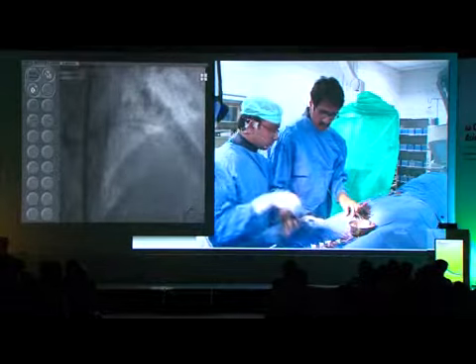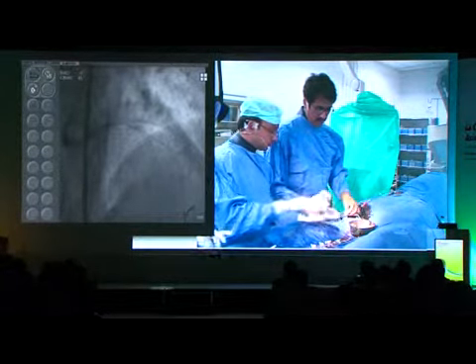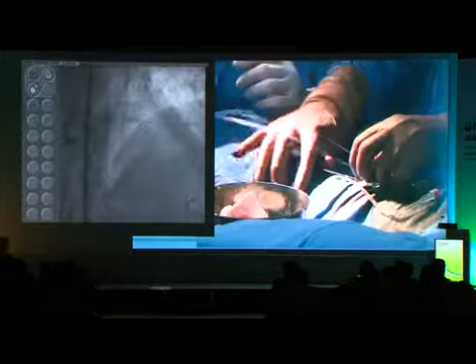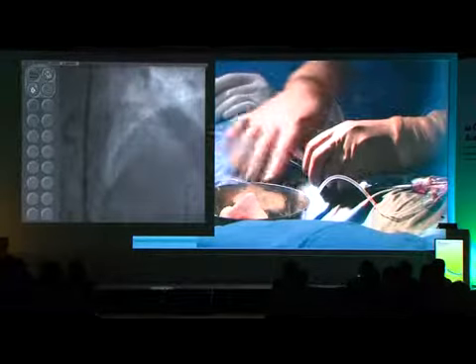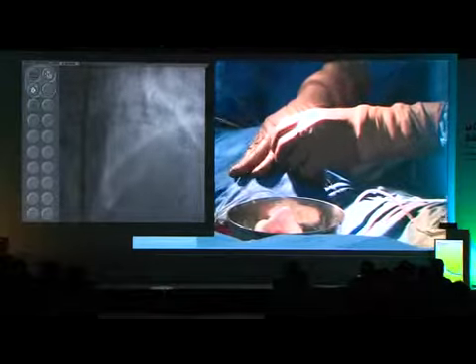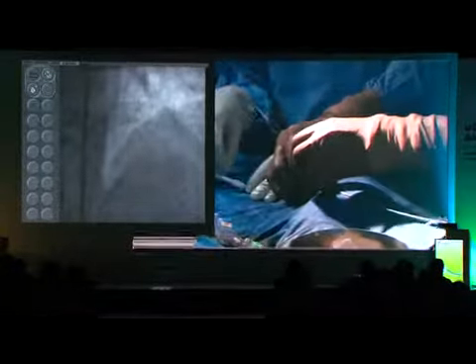What about diagonal, Shirish? Now you are going to use another stent for the proximal diagonal? Yeah, I think we have to use another stent for proximal diagonal. This stent will cover just probably 1 or 2 millimeters of the side branch.